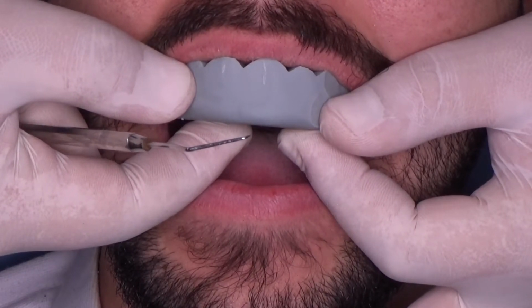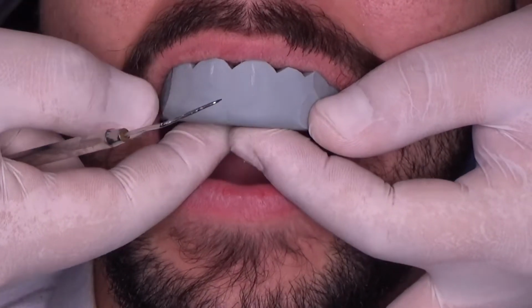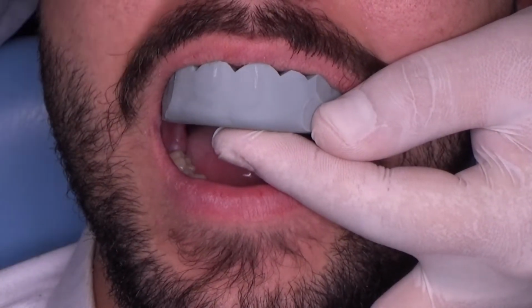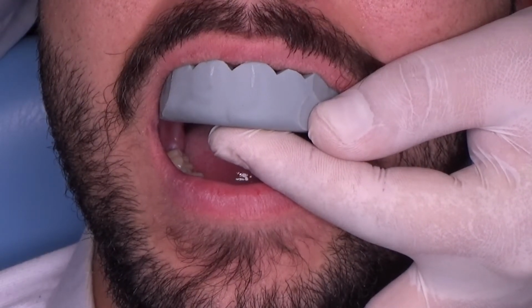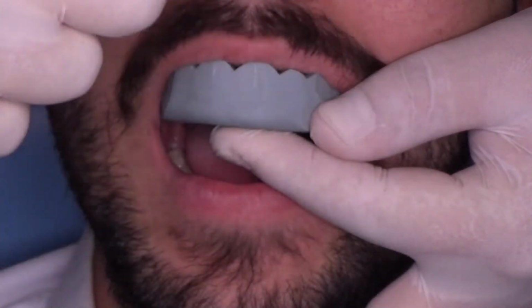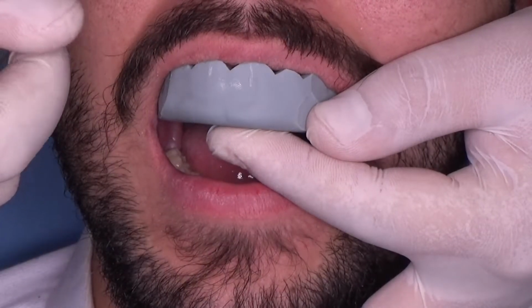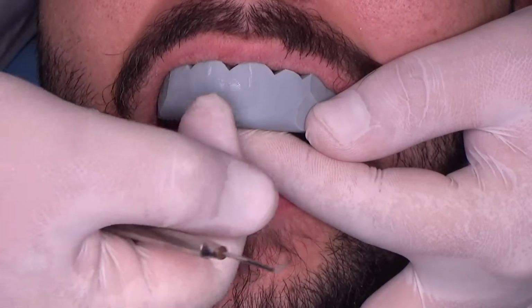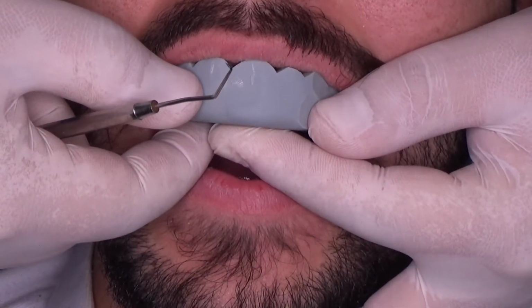How do you do the mock-up on the central? In such cases, when you have to remove, the mock-up is perforated by the tooth, which means the edge which should be removed goes through the mock-up. You can mark it with a black pencil to see which part should be removed. First remove this part and then continue with the standard procedure.